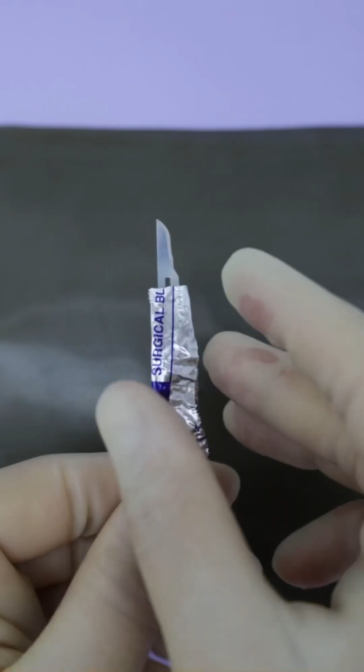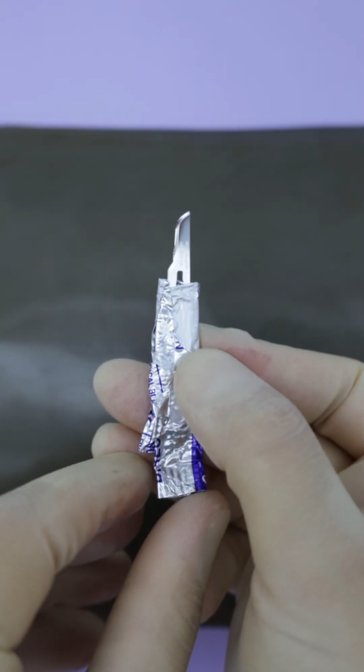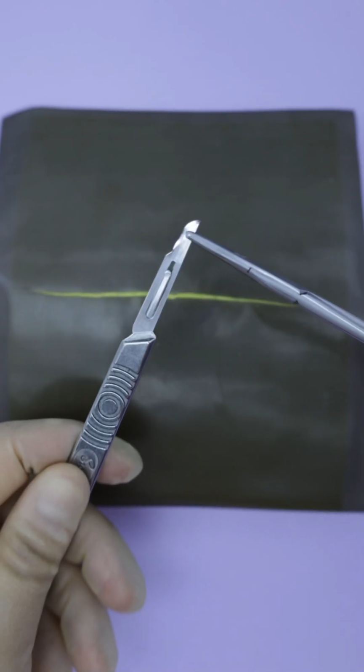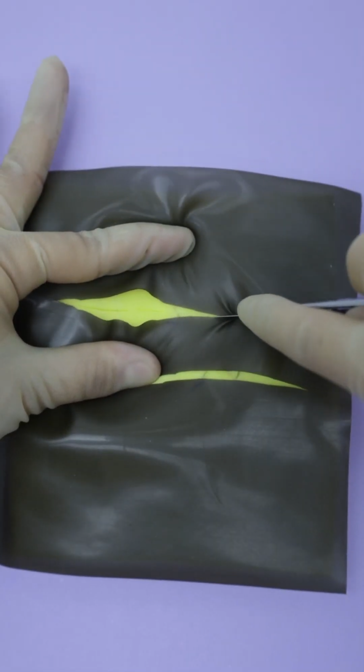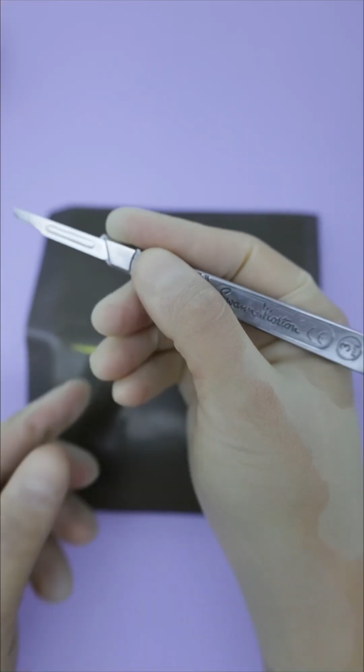And this improvised handle being shorter than a regular handle shouldn't be a big issue, because even with regular scalpel handles you would be holding on closer to the blade for maximum control, meaning unless you have giant hands, the rest of the handle isn't usually used.